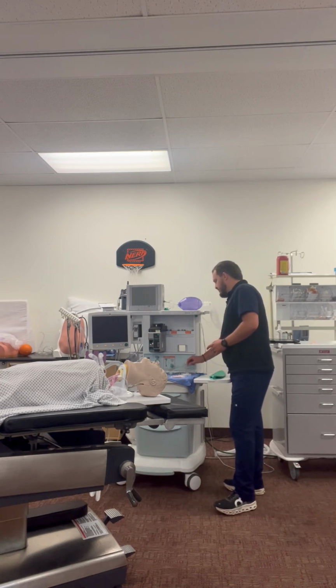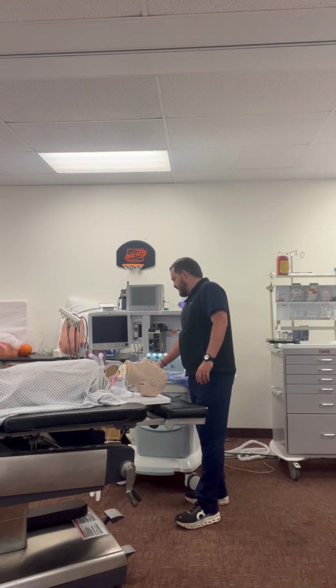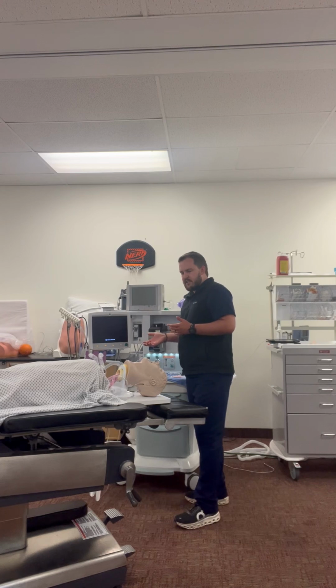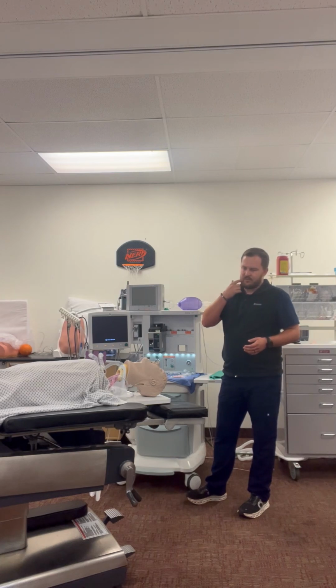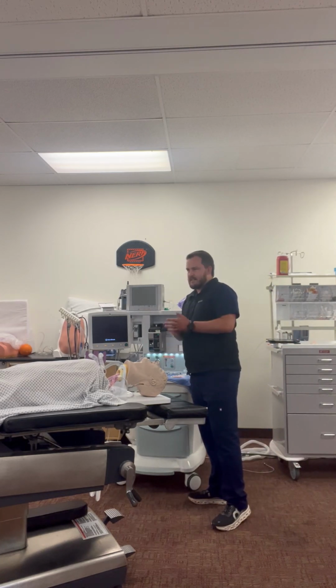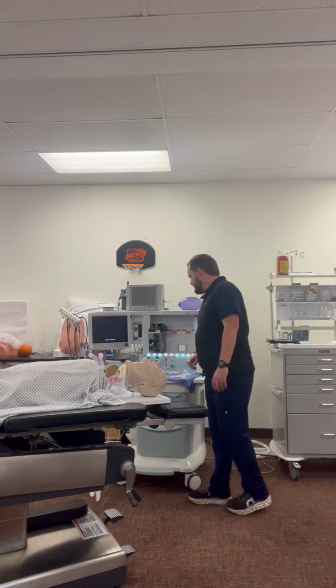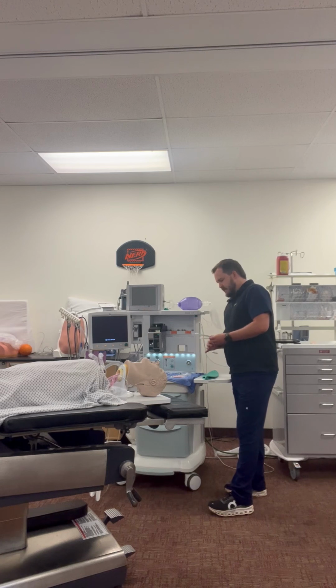So first I'm going to start with the airway, since he does have OSA and large tonsils. I'm going to make sure I have multiple OPAs. One that is appropriately sized to him that I sized in the room, which should go from the back of the jaw to the corner of the mouth. And then I'm going to have a slight size up and down, just to make sure if his anatomy is different, I'm prepared. And then I'm going to have my ET tubes ready.